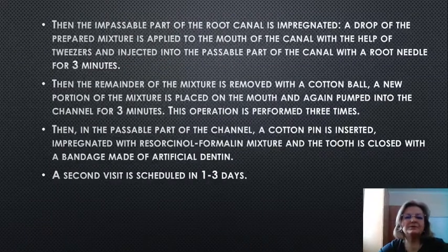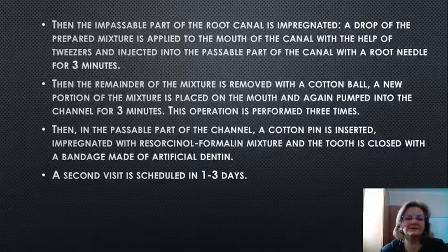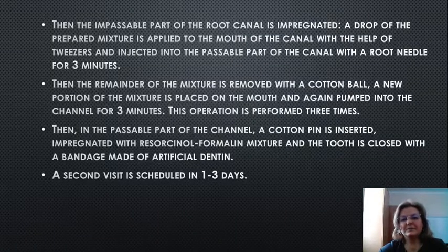Then the impassable part of the root canal is impregnated. How is it impregnated? A drop of the mixture is applied to the mouth of the canal with tweezers and pumped into the passable part of the canal with a root needle for 3 minutes.